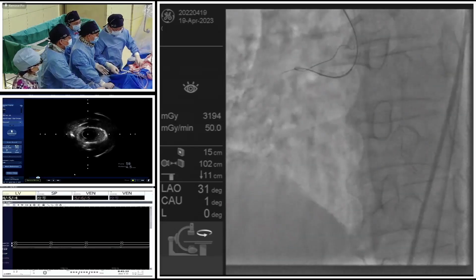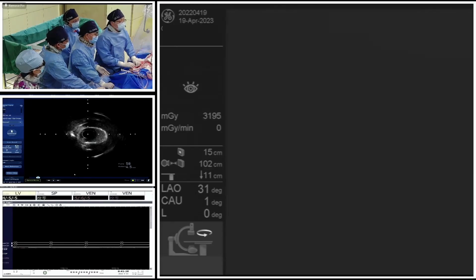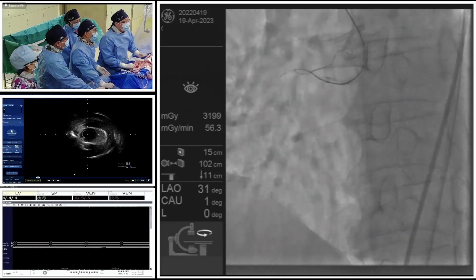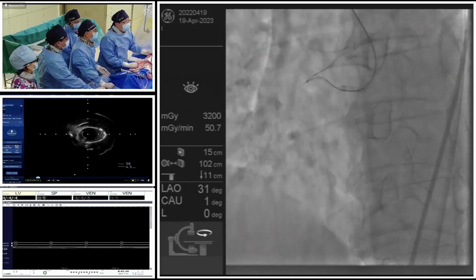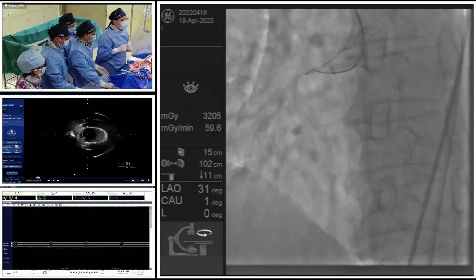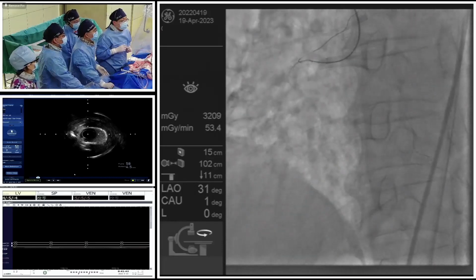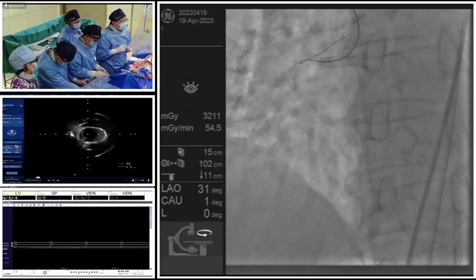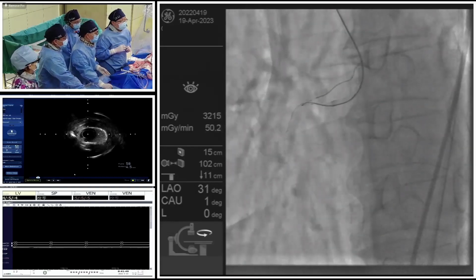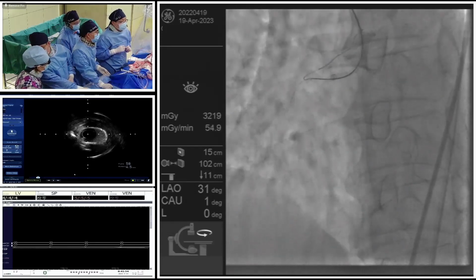And also the side branches at the proximal part could be troublesome, because we know a CTO with bifurcation is relatively hard to puncture into the center part because of the coaxial direction of the guiding catheter and also the side branch. I think if that fails, I will try the retrograde approach. Sometimes rapid switching is also a key point of the hybrid strategy.